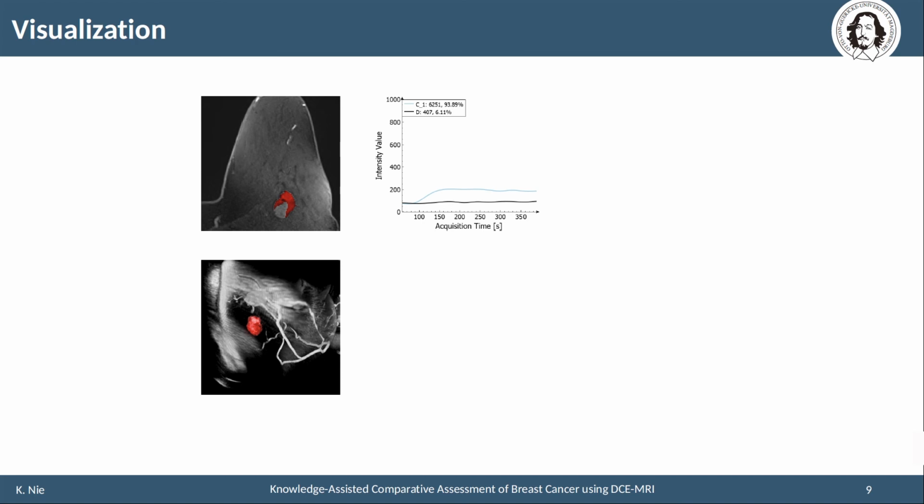The first entry shows the corresponding color. The second entry is the name of the cluster. The third entry is the number of voxels of the cluster. The last entry describes the relative size. When a representative curve is selected, its 50% region and the envelope region are shown.